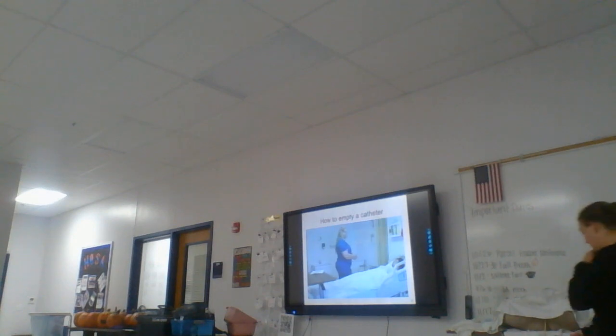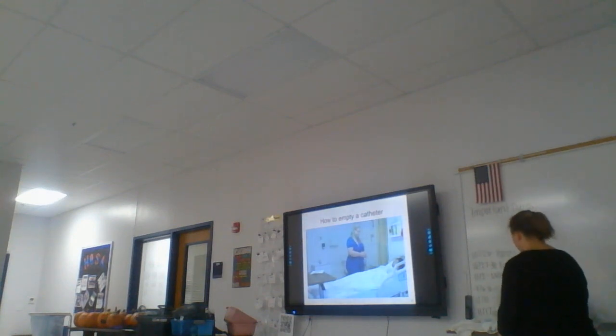Hello, Ms. Jones. My name is Patty. I'm your CNA today. How are you? Great. Introduction. I need to empty your urinary drainage bag. Is that okay? Explaining the procedure. Okay, I'm going to close your curtain, wash my hands, get my supplies, and I'll be right back.